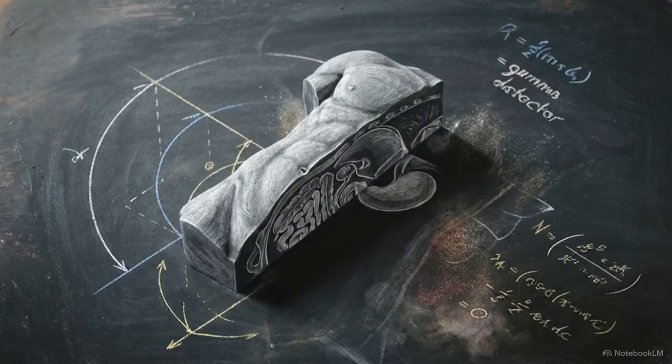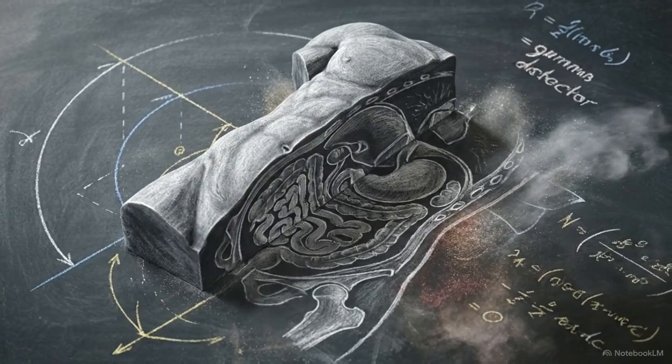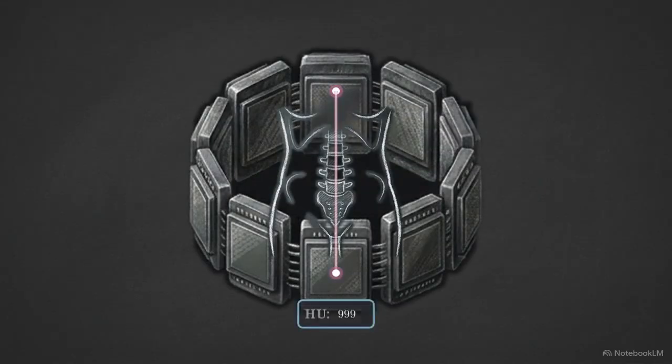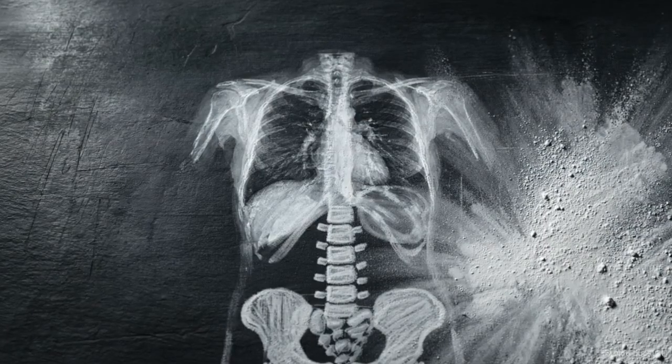When most clinicians evaluate a scan, they expect to see something exactly like this. That clarity comes from transmission imaging. A CT scanner fires a tightly controlled external beam of X-rays through the body, plotting the physical density of the structures inside. But when we shift from mapping anatomy to mapping physiology, the picture changes entirely.